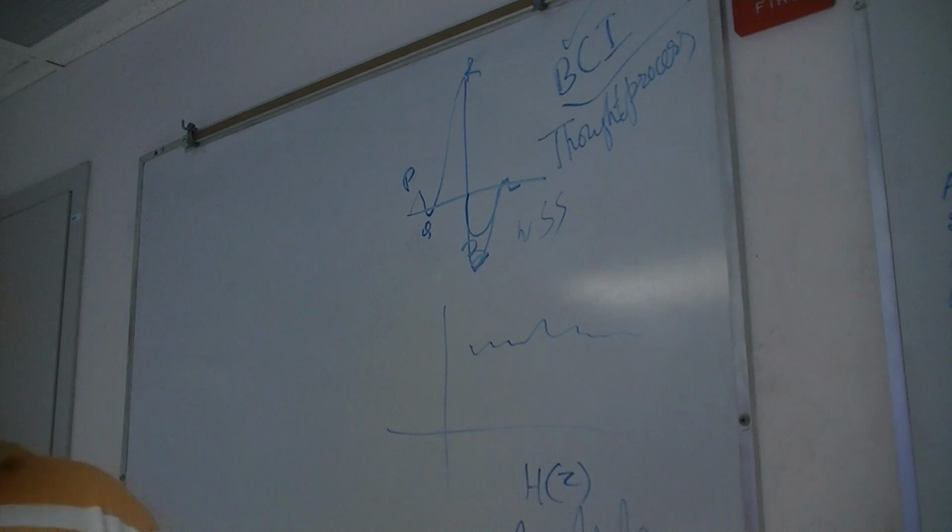You want what type of signature? It's a simple thing. When an EEG is being taken, it's very difficult for any person. If the EEG goes for 45 minutes and you tell the patient not to move the eyes and to lie straight, it's very hectic. During the EEG, naturally, he's thinking something, his eyes will be blinking, and there will be an impact on the EEG signals. The EEG signals will be distorted due to these movements.